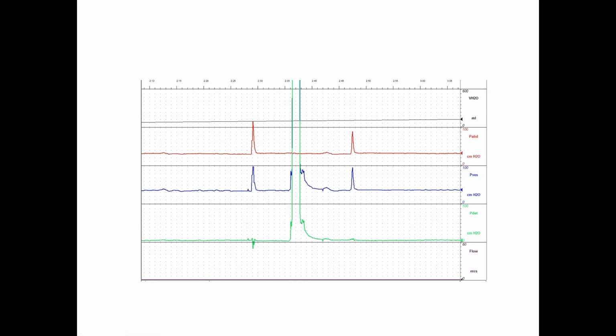You need to make sure you turn your taps back into the correct position in order to start recording from your patient again. And once you have done anything to rectify the quality, you need to check it. There's no point doing anything in terms of a remedial action if you're not going to check it. So you've had an issue, you've troubleshot it, you've worked out which line it is, you've performed some form of action to try and remove an air bubble. That's what you're thinking it's likely to be if this is dampened. And the outcome is a lovely cough test with almost no response from your detrusor line. And then you can continue.